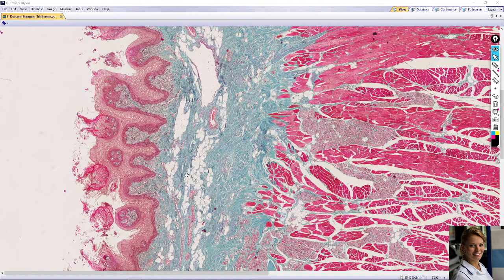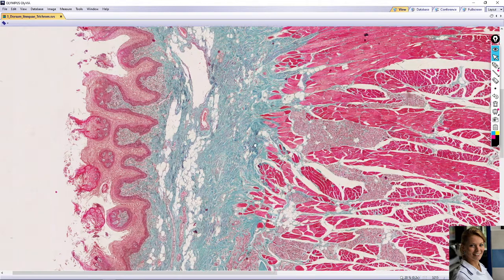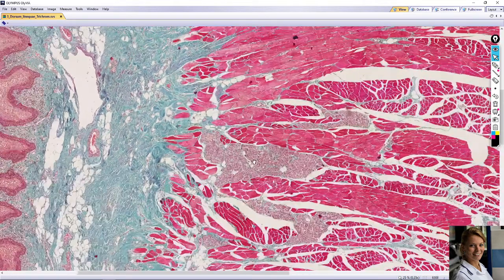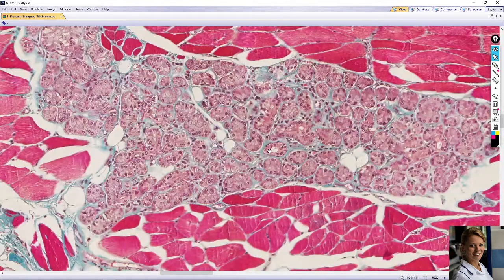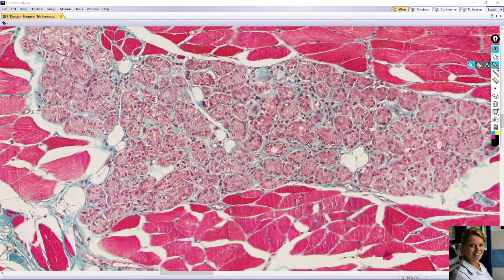Located deep in the lamina propria and core of the tongue are numerous tubular acinar serous glands — for example, here. The name of these glands is also von Ebner's glands. The serous cells have round nuclei and basophilic cytoplasm because of the zymogenic granules in the cytoplasm.